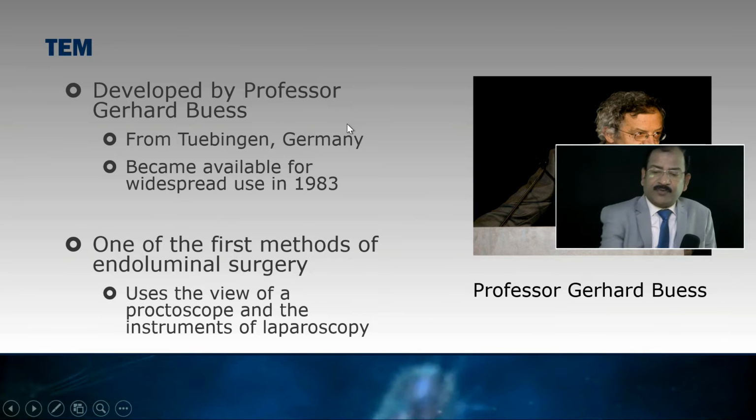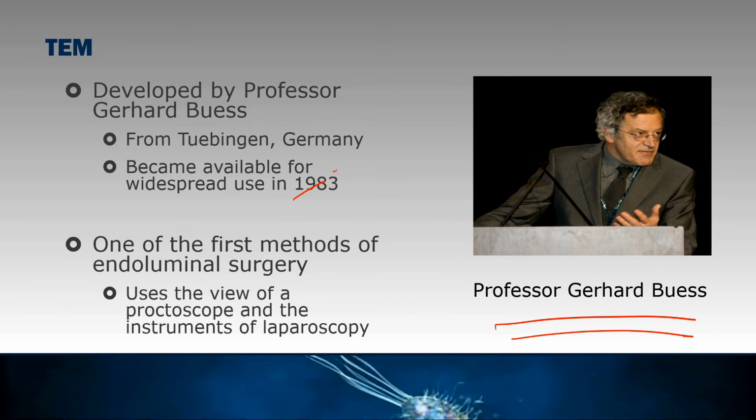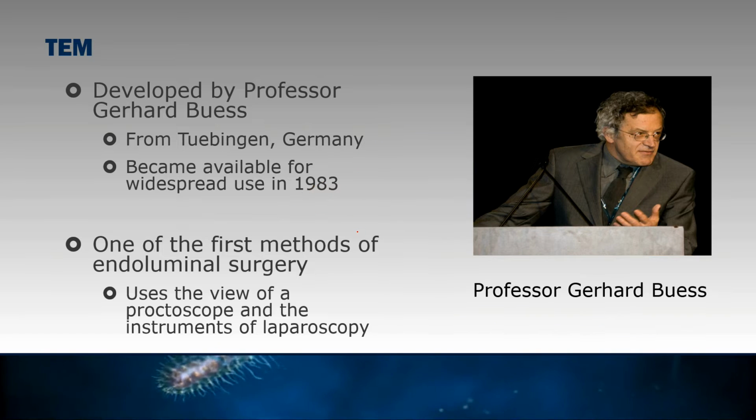Now, one procedure which I would like to demonstrate for colonoscopy, which is just a little away from the list, is the TEM procedure. TEM is called transanal endoscopic microsurgery. It was invented by Gerhard Buess. Professor Gerhard Buess was the head of the department at Tübingen University, Germany, and he invented this, and it is now widely used all over the world.